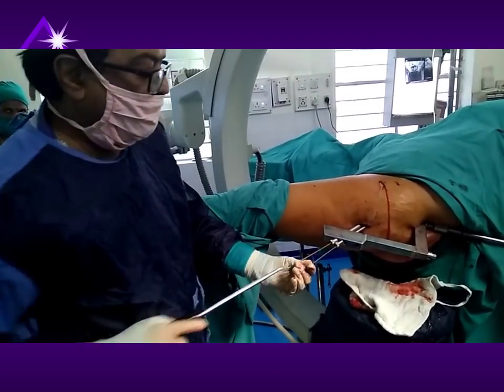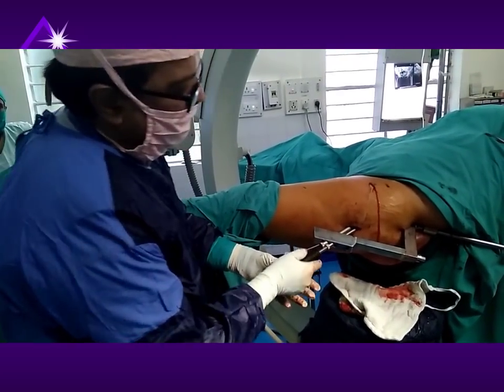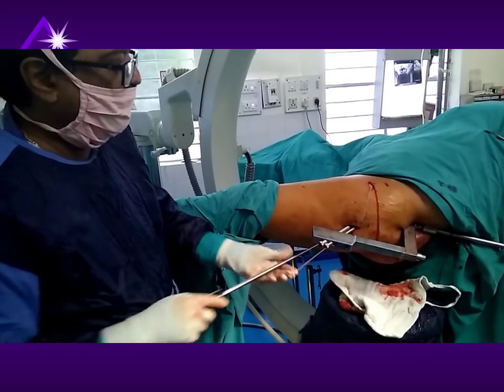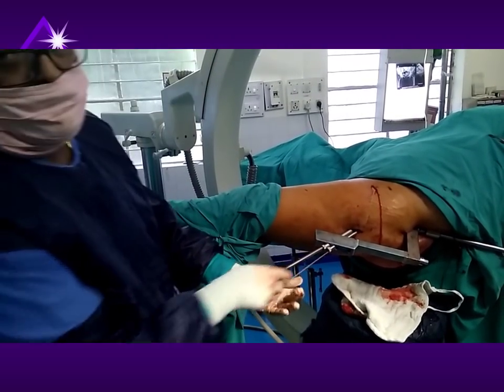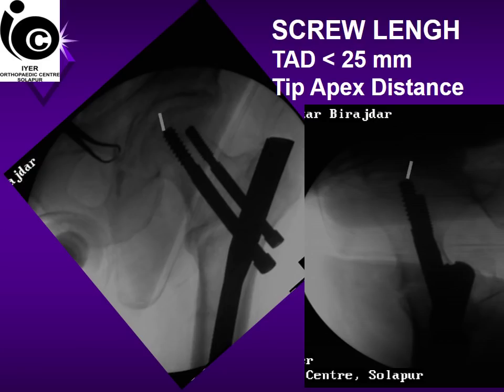See, I'm feeling how much I'm able to compress. You should not compress one screw and continue to try to compress. So alternately, compress both the screws till you are satisfied. The length of the screw is also very, very important. The TAD is very, very important, as said by Baumgartner.